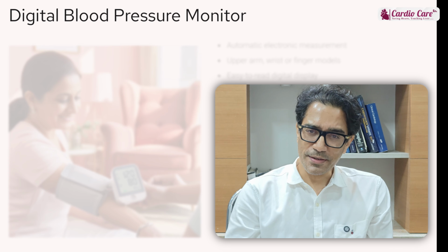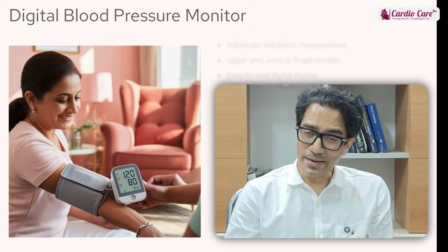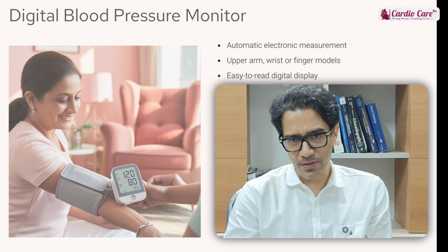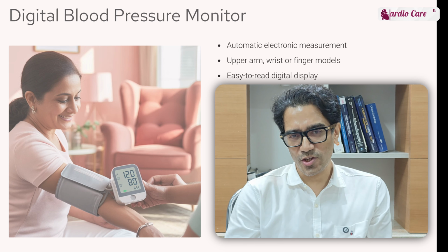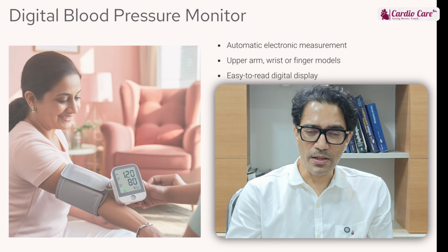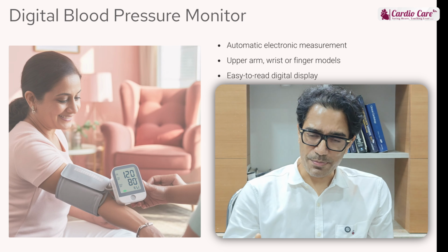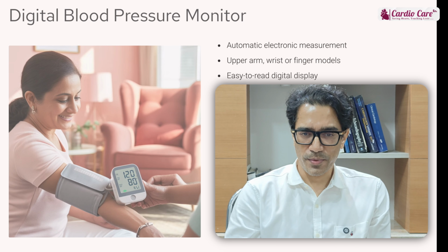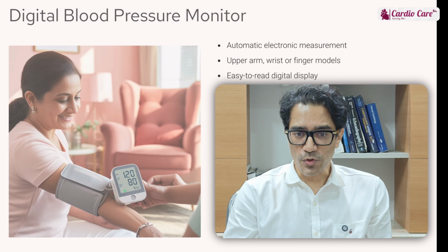What about the third device? The third device through which we can check the BP is the digital device. These digital devices are quite user friendly because you do not require specific training for that. Anybody and everybody can check with it. Even an old person, a senior citizen, can check it at home. That's why they are very commonly used, especially in the home setting, where we do not always have expertise. You do not always get a doctor or a healthcare professional to check your BP at home. So for self-measurement of BP, digital monitors are most commonly used.